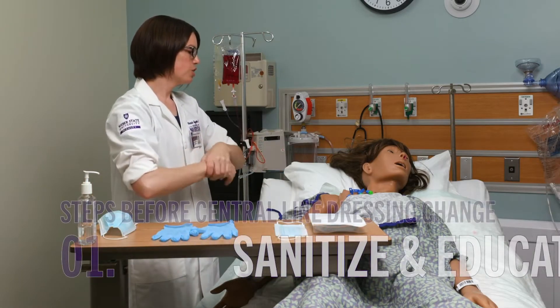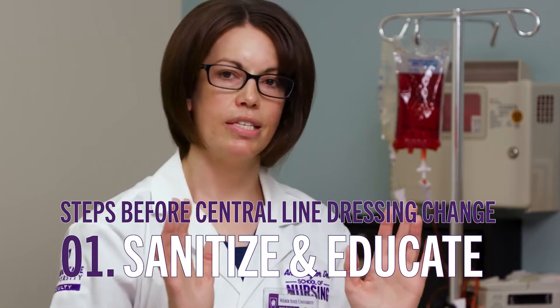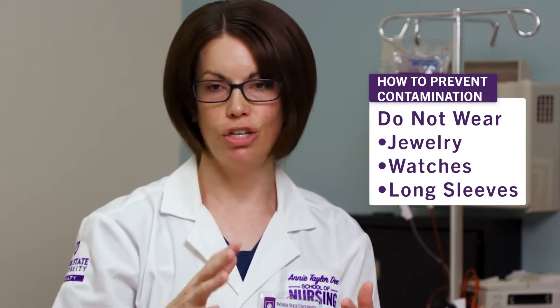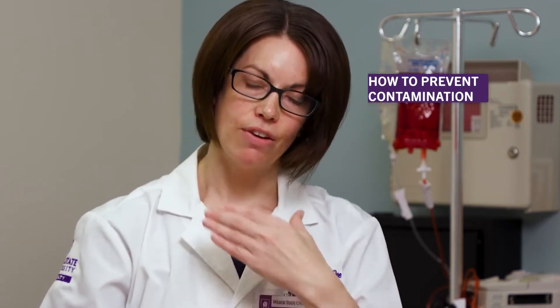Next I want to educate the patient on the reason for doing this dressing change. I also want you to notice that from my elbows down I don't have any jewelry, watches, or long sleeves. Make sure your name tag or lanyard is flipped back behind you so it's out of the way, so there's no risk of breaking the sterile field and causing any sort of infection.